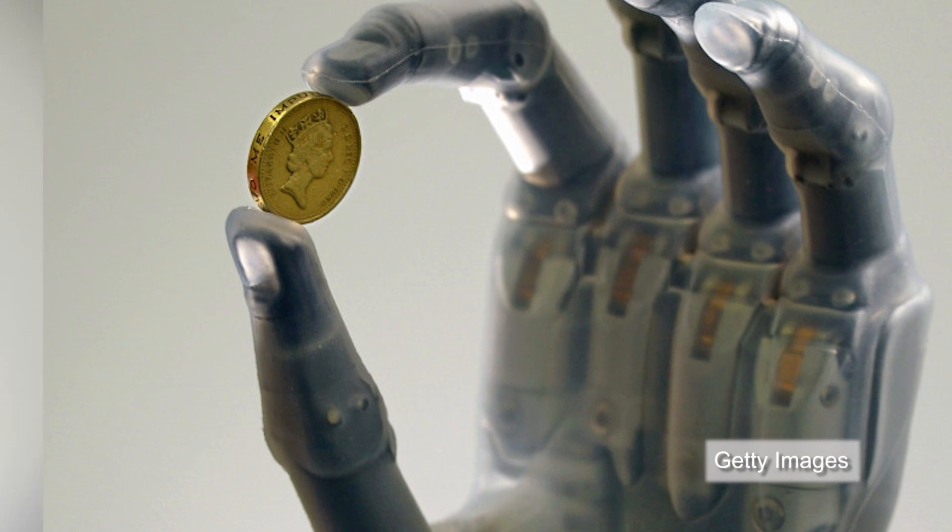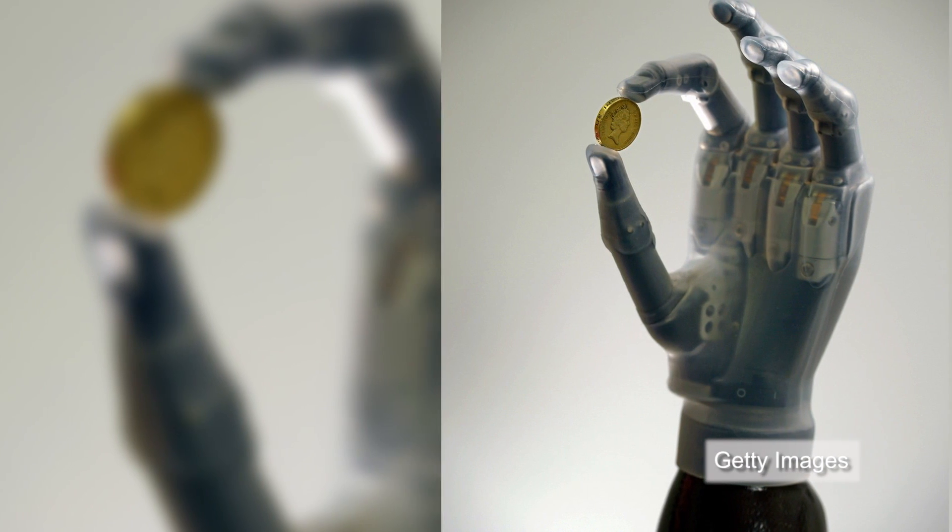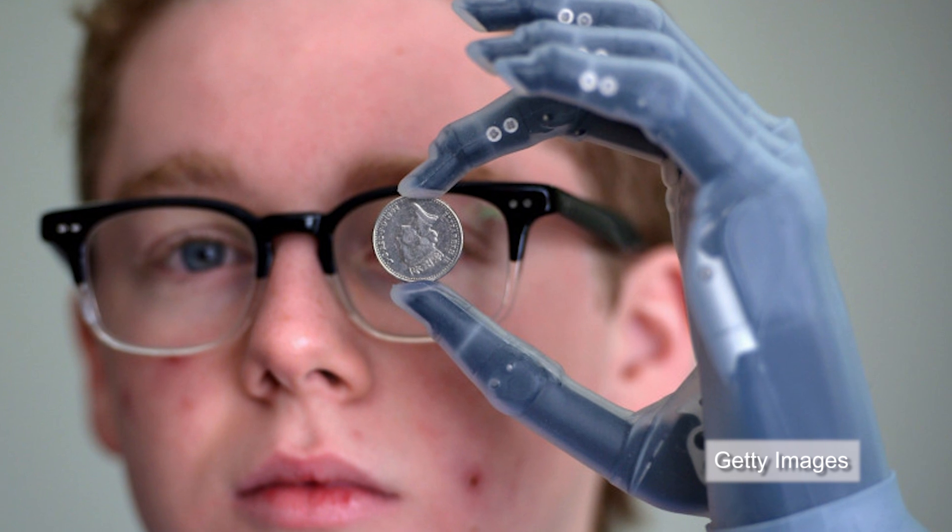Future systems will include up to 13 angles of motion and pre-programmed patterns, much like Touch Bionics' i-LIMB myoelectric hand.